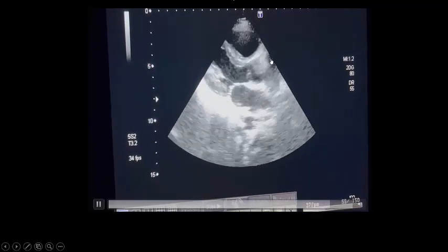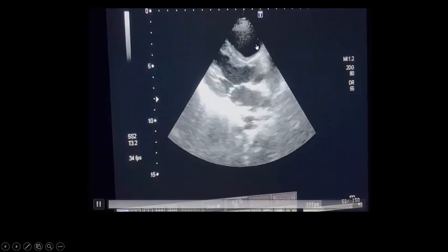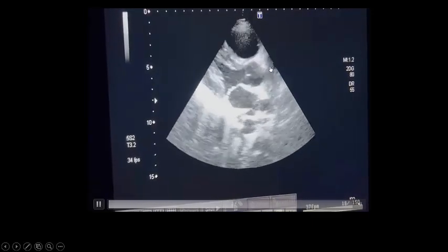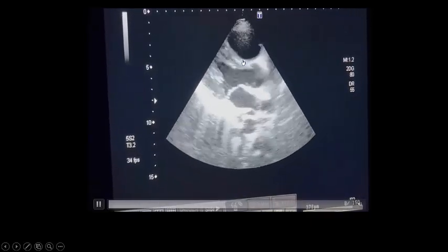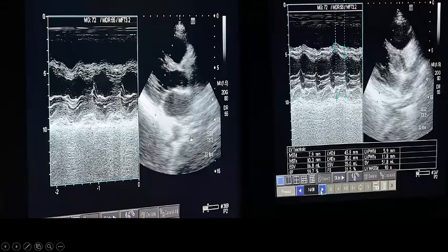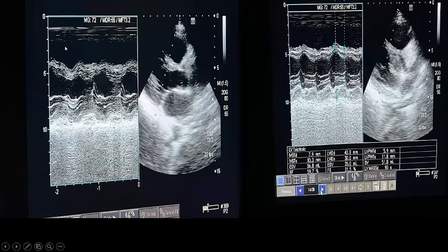This is the long axis parasternal view. You can see the right ventricle appears dilated and is compressing the left ventricle. The left ventricle is contracting well, almost kissing. With M-mode, you can see the ejection fraction is almost 60%. The left ventricle is doing well but is compressed by the dilated right side.